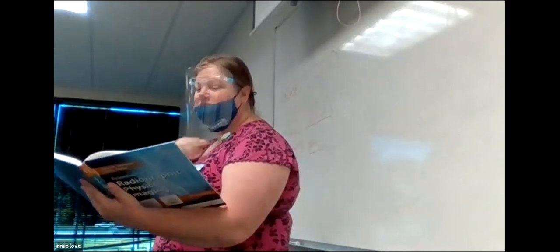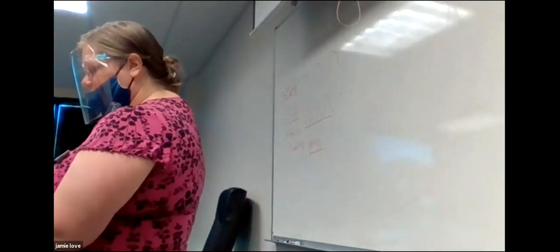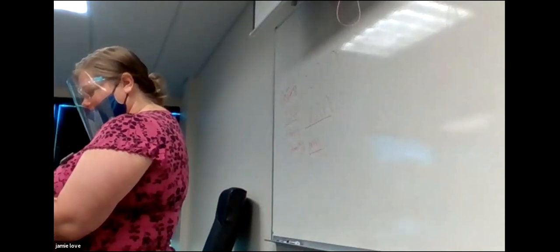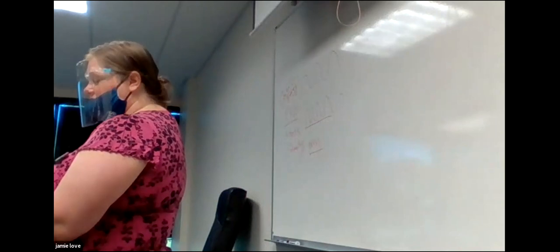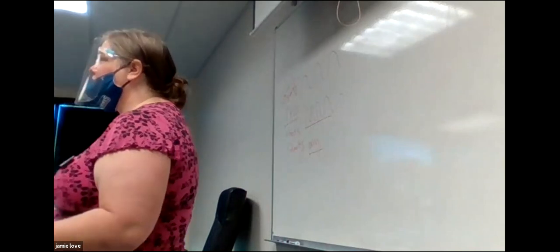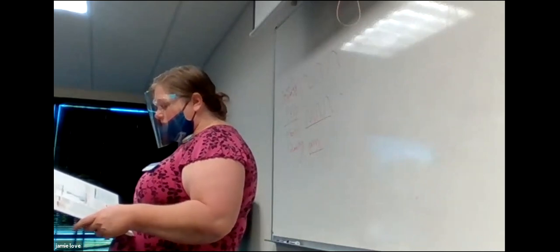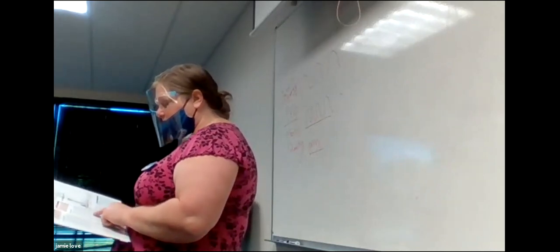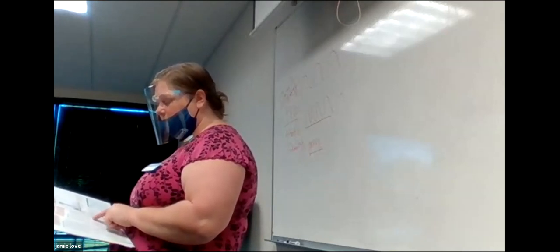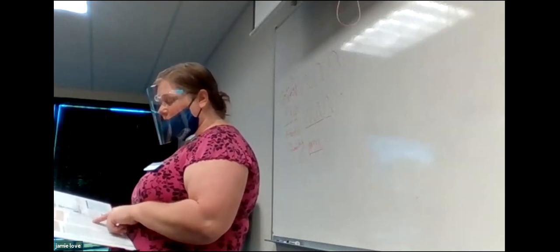All right, page 66, I just want you to highlight something on the quantity before we move on to quality. Second paragraph underneath quantity. It says beam quantity, the bold word under beam quantity. So quantity is the number. If beam quantity varies by the square of the ratio of the change in KVP, if KVP is doubled, the intensity, the quantity, increases by a factor of 4.